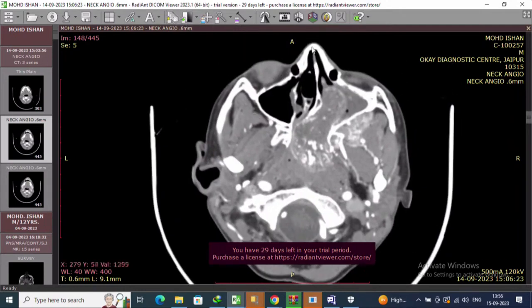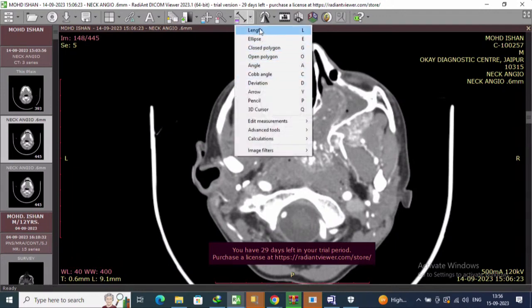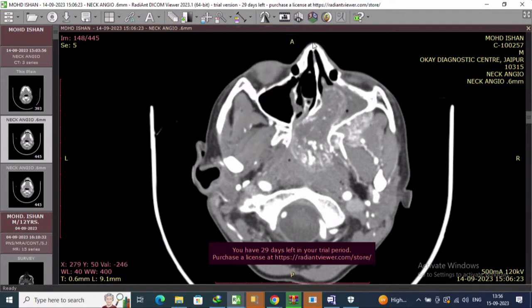The reason being, see the endonasal space on this side and this side. Yes, sir. This tumor is projecting inside the endonasal space like this and narrowed the space. Now, to approach this tumor which is coming far laterally, what would be our approach? We would be doing a modified Denker's. I would be removing this medial wall of the maxilla as well as part of the lateral wall of the maxilla like this. And then we'll have a thorough, head-on access to the posterior wall of the maxilla and behind.